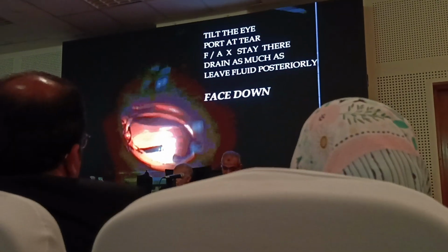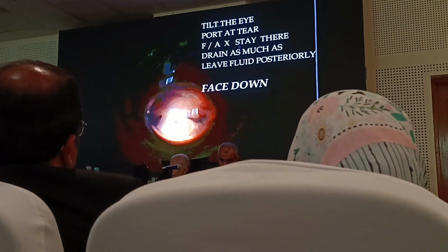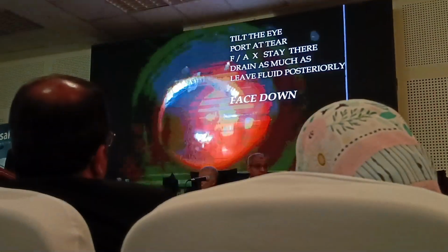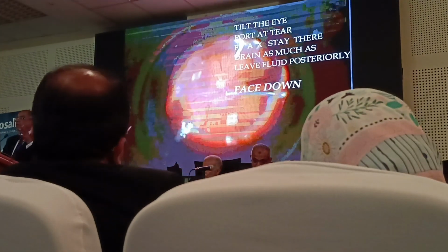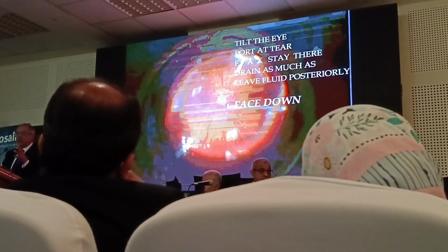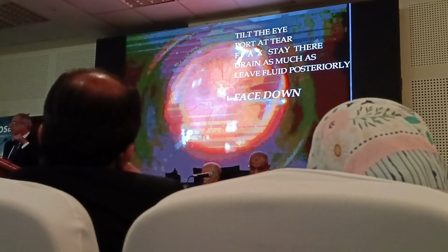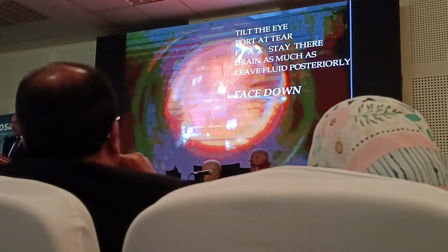Perfluorocarbon liquids facilitate drainage of subretinal fluid, but actually you can perform almost complete drainage without perfluorocarbon by tilting the eye, starting fluid-air exchange, having the vitrectomy port close to the break. When the air bubble enlarges, you lose view for a while. Just keep stable, don't move anything, and keep sucking fluid. After a short while, the air bubble increases enough for you to see the drainage site at the end. So everything has to be performed patiently.